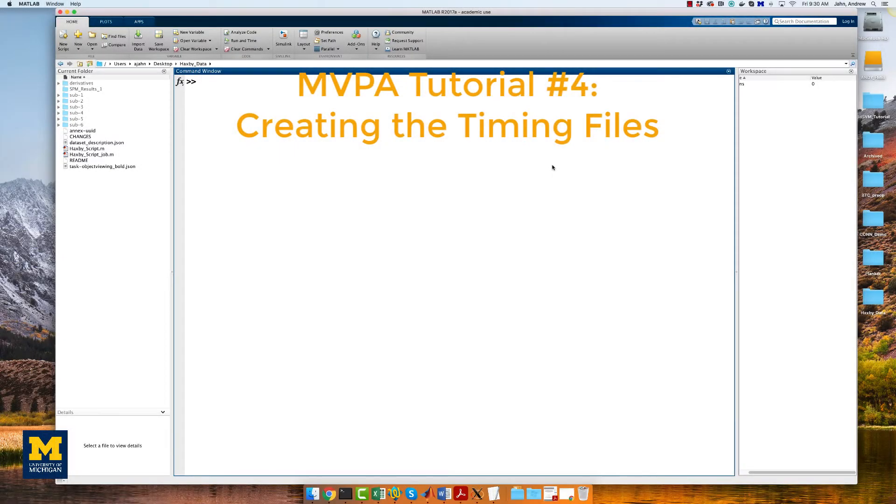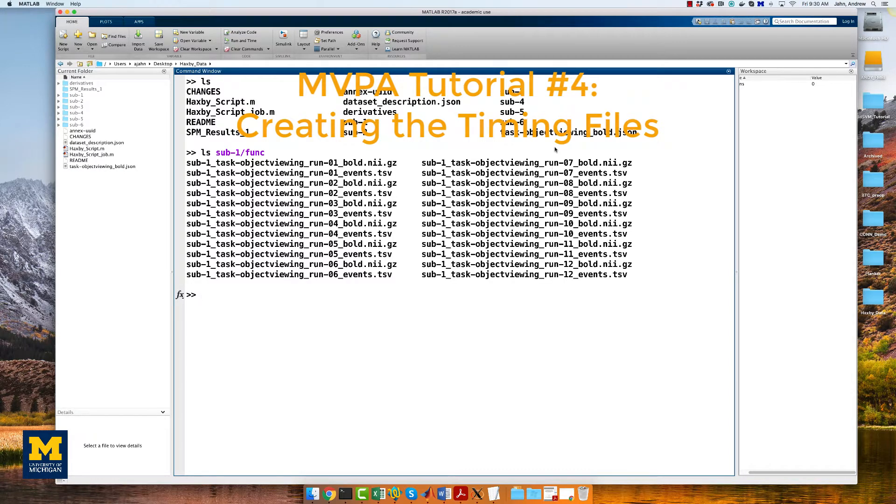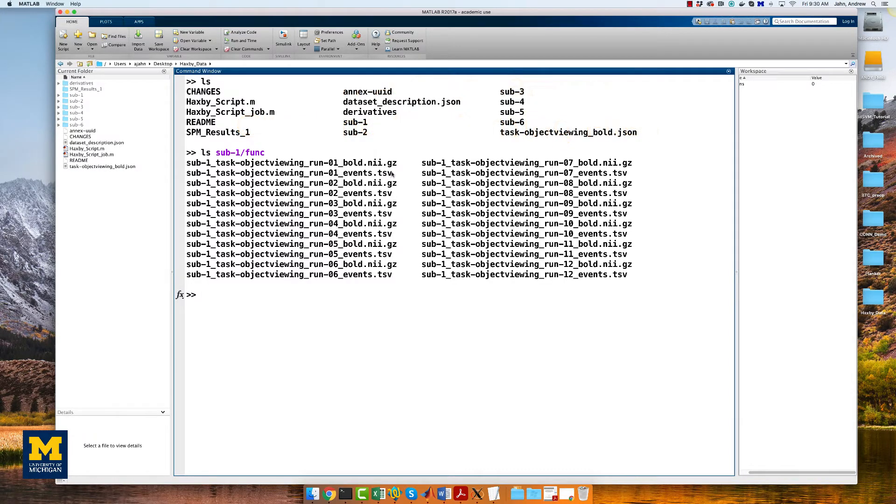Once we have created a template script, we will need to load the timings for each run. Each subject in the dataset has 12 timing files in their func folder, corresponding to each run of functional data.